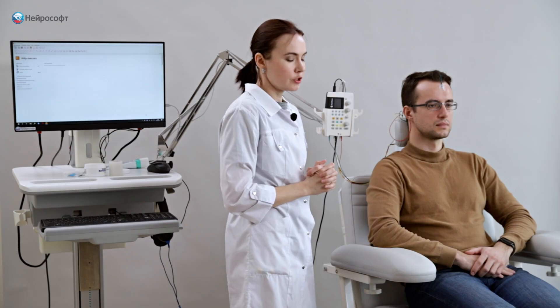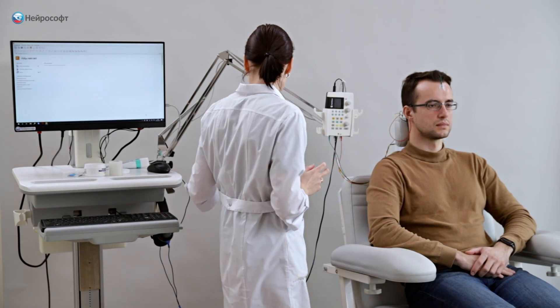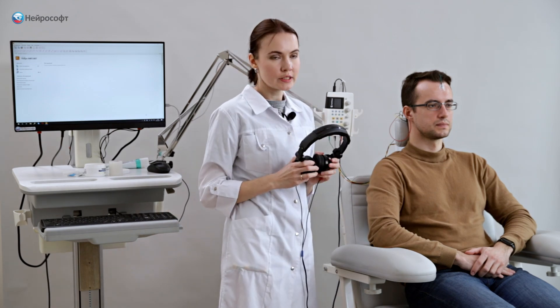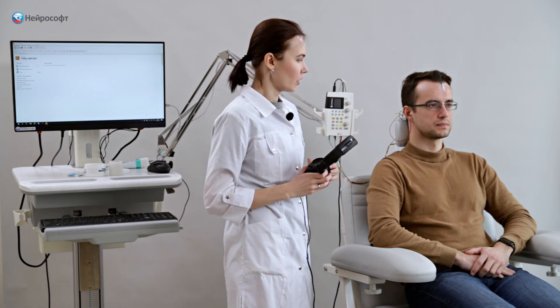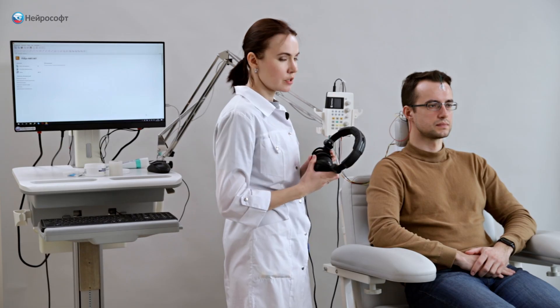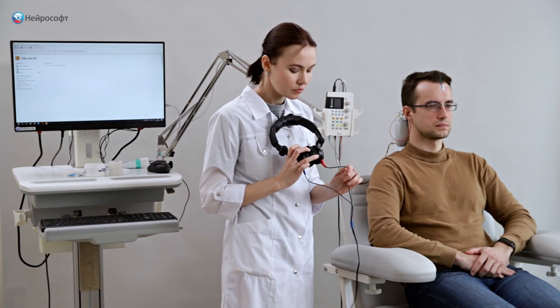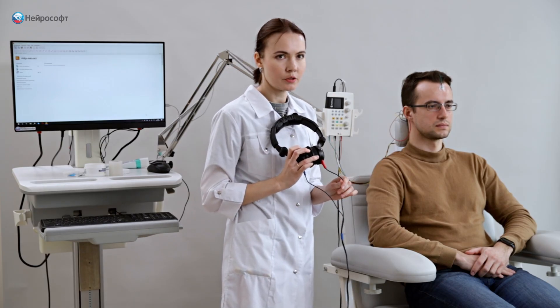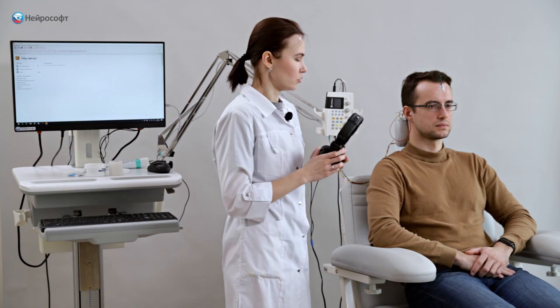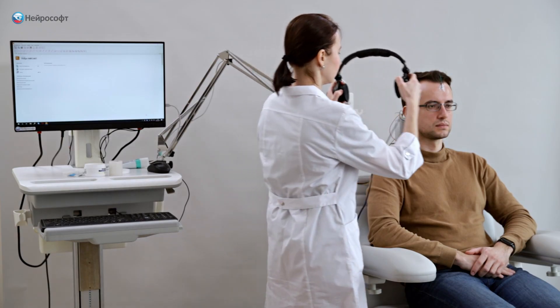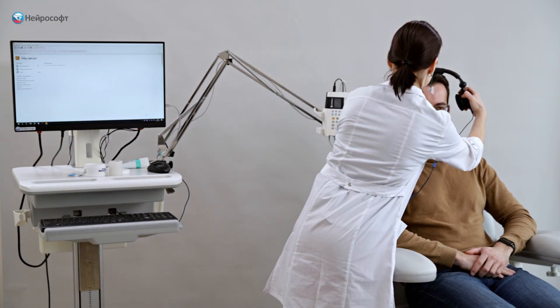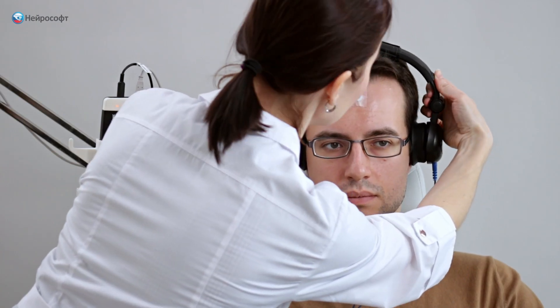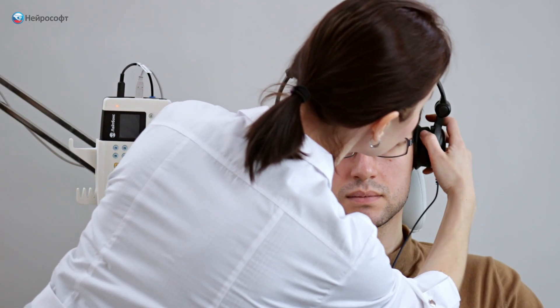As a stimulator, we can use various devices. Today, we are using the TDH39 overhead headphones. Put them on the patient, according to the color coding red on the right ear, blue on the left ear. Adjust the headband.